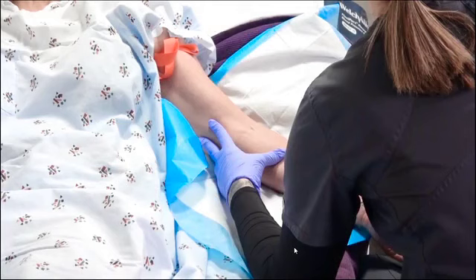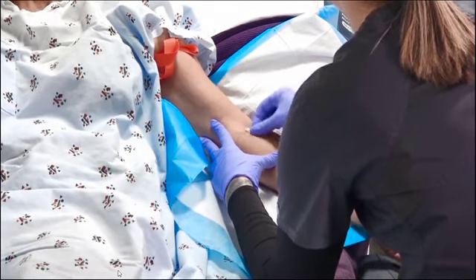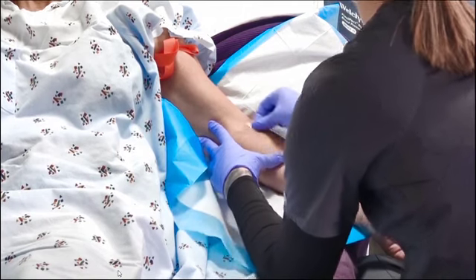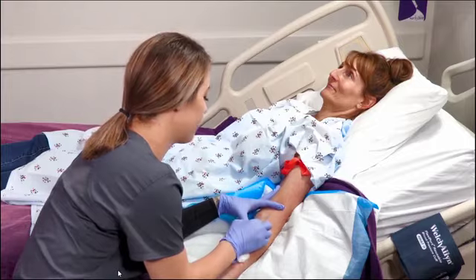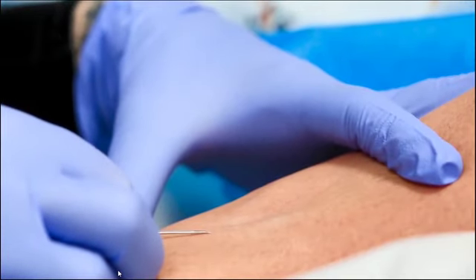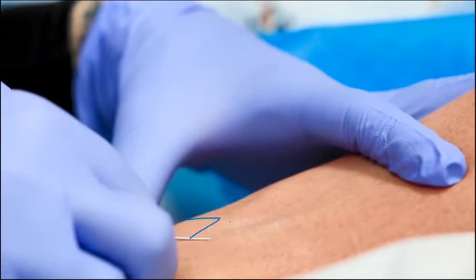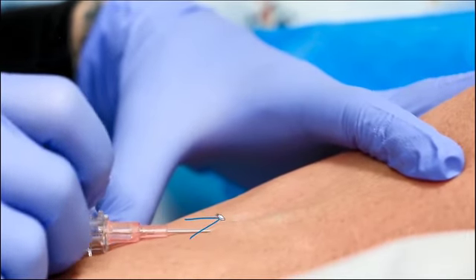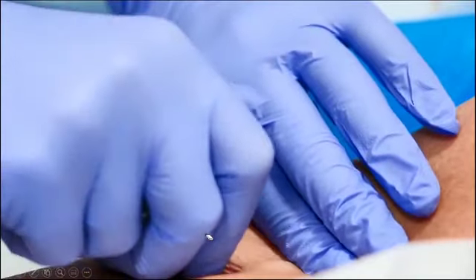I'm just going to walk you through it, but I want you to see what the process looks like. So the tourniquet is already applied, and now we're just palpating that vein. Now there are the concentric circles with the antiseptic, the ChloraPrep. She's going to use that left hand to anchor down the vein and then use that 10 to 20 degree angle, which is right about here, to insert into the vein. Once she gets the flash, she advances the catheter, applies pressure.